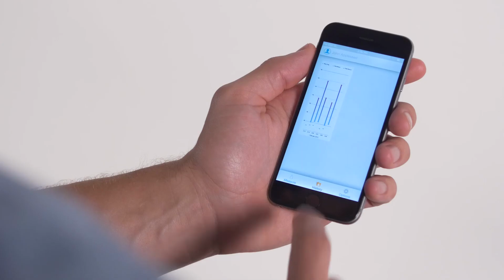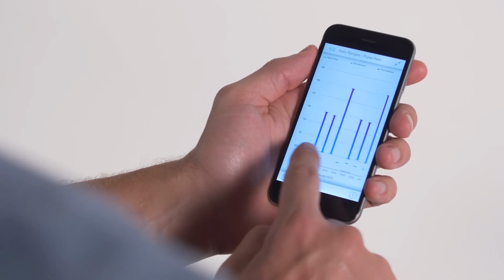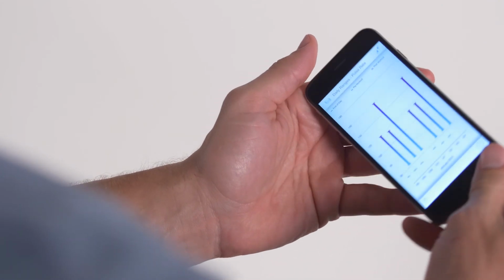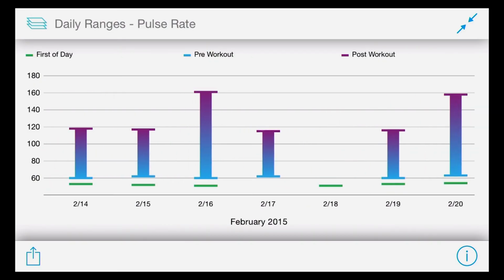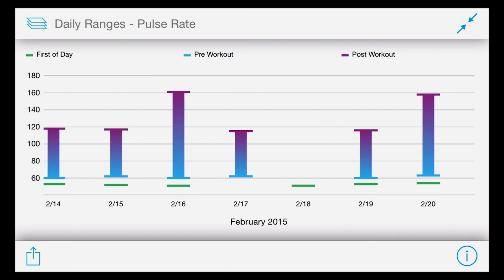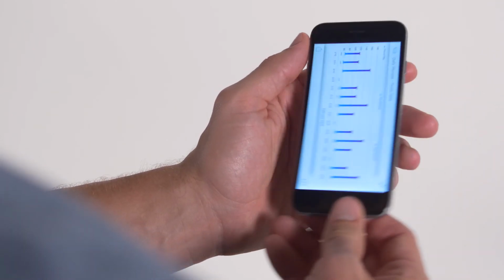Let's look at how John's daily workouts affect his heart rate and what he can learn. Here we can see John's first of day pulse rate is represented by the green rectangles, typically his lowest of the day. His pre-workout measurement is blue and his post-workout measurement is purple. The pre- and post-workout measurements are connected visually to show you the range that your heart rate experienced because of working out on that day.